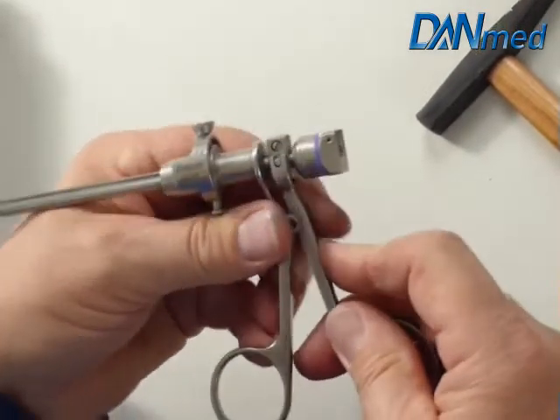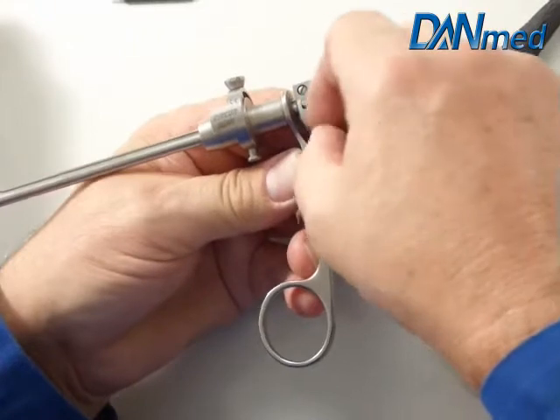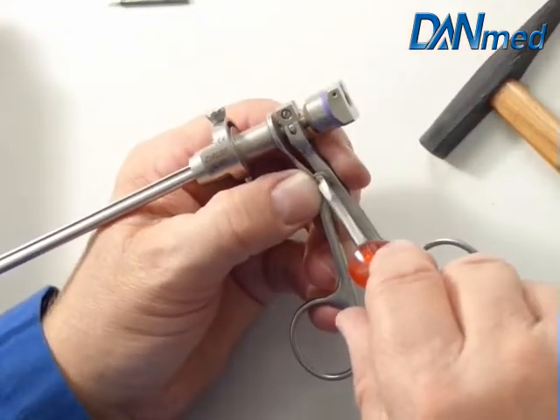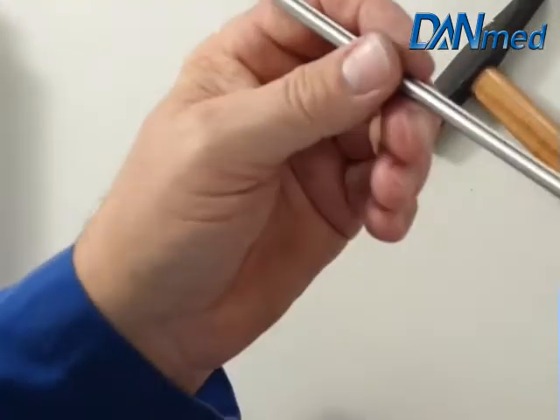Now the handle part. The second handle part goes back. Center screw for the handle. Screw it together. Make a check.